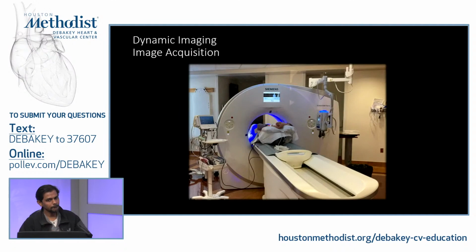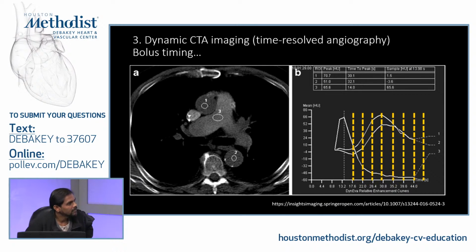I think your analogy with DSA is a really good one. You inject the dye, you wait 20 seconds, you turn on the X-ray and you can't see anything. It doesn't mean the dye wasn't there, you just haven't acquired at the right timing. The same thing happens here. For example, one of the things we found useful was dye arrival times in the aortic aneurysm sac. If it arrives at the same time as dye inside the aortic stent graft, it's probably a type 1 endoleak.